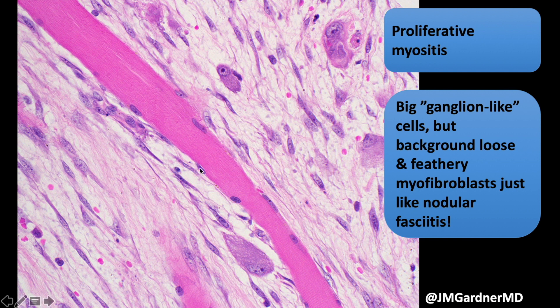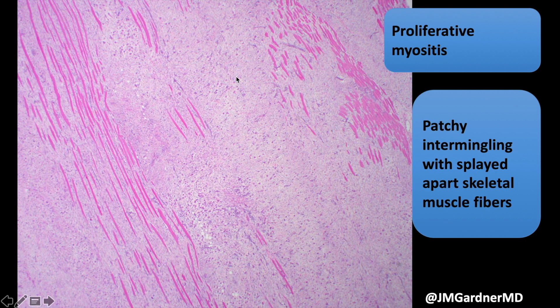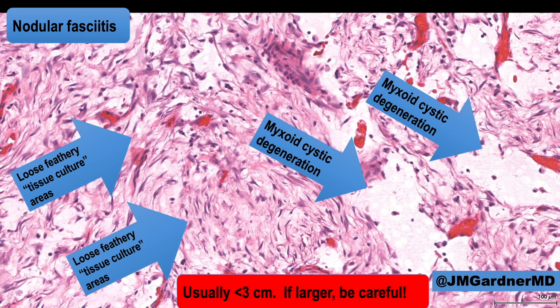What's really helpful is if you see skeletal muscle fibers suspended in the loose fasciitis background along with scattered ganglion-like cells. This pattern of patchy intermingling of splayed-apart, sometimes atrophic skeletal muscle with intervening tissue that looks like fasciitis and scattered ganglion-like cells is very reassuring for proliferative myositis from low power. Start at low power — don't go straight to high power or you'll alarm yourself.